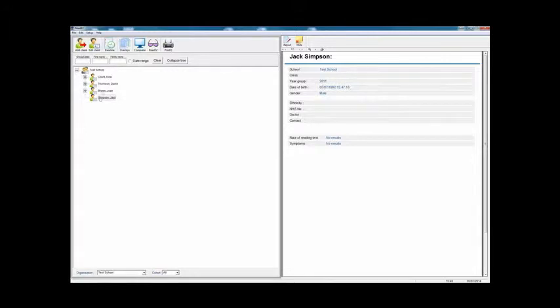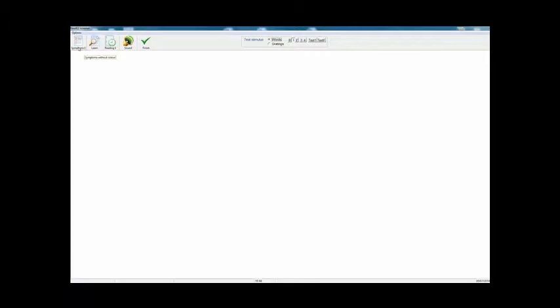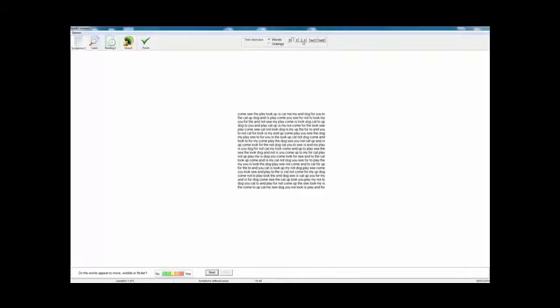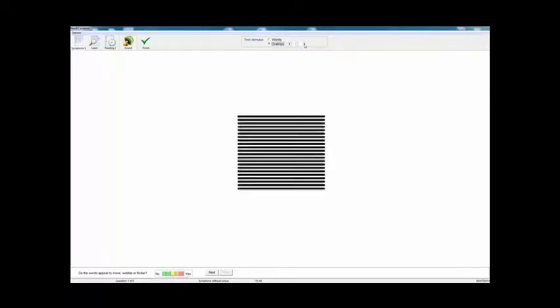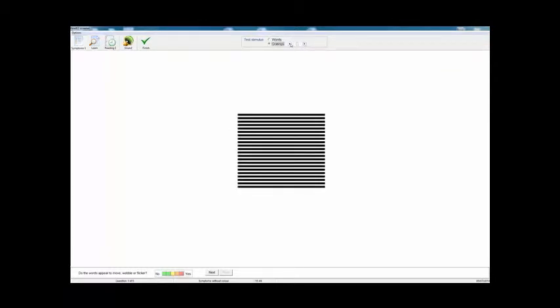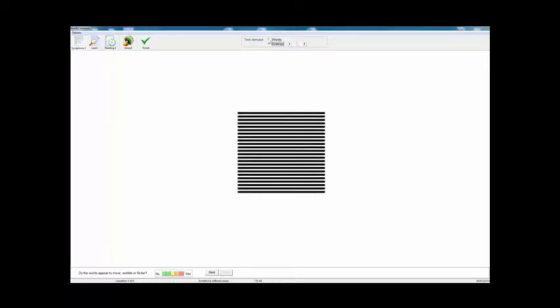The first stage when you're screening is to get some baseline measurements against the white background. We can then use those to see if there's any increase in reading speed and decrease in symptoms when we add color. So you just click on baseline at the top of the screen. The first stage would normally be to ask about symptoms. You'll see that this puts up a passage of text — it's just random text, known as the rate of reading test. There are several different passages of words, four different alternatives, or you can just randomize the words. Or if you prefer, you can use a grating, sometimes known as the pattern glare test, which can be quite sensitive for eliciting the symptoms of Meares-Irlen syndrome.